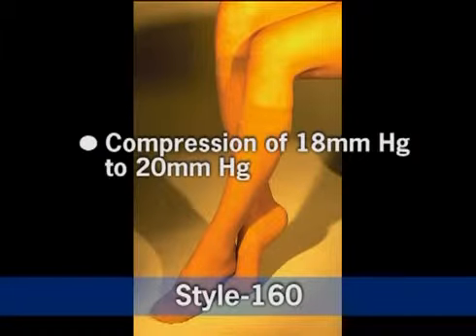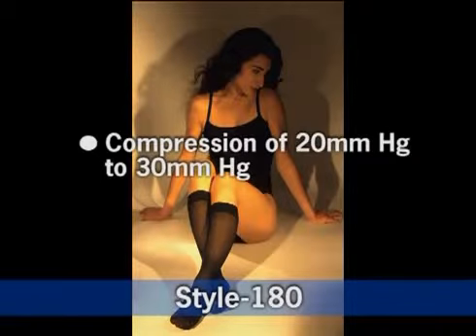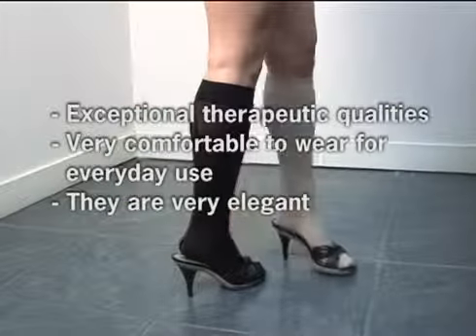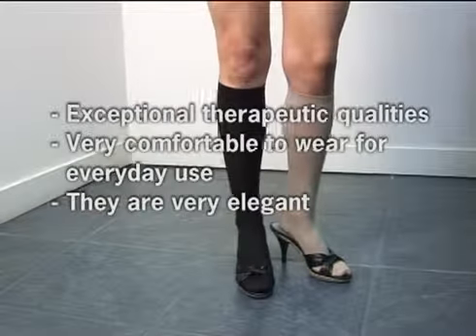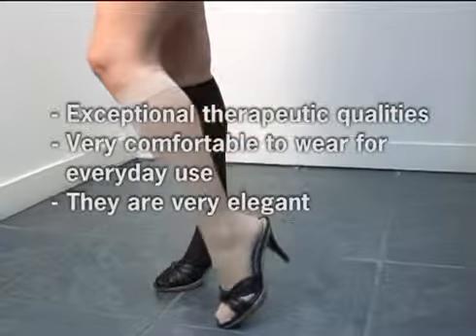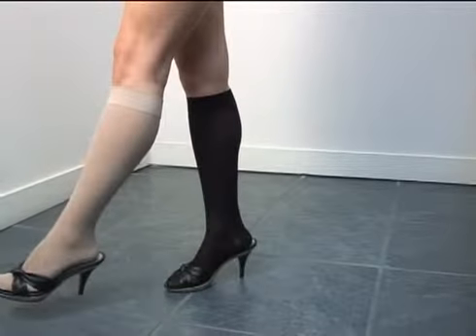Style 160 comes in compressions from 18 to 20 millimeters mercury, and our Style 180 comes in compressions of 20 to 30 millimeters mercury. ITA Med compression hosiery has exceptional therapeutic qualities, are very comfortable for everyday use, and are very elegant. The stockings have been designed for women with a sheer design and were designed for prevention and treatment. They come in beige, nude, and black.